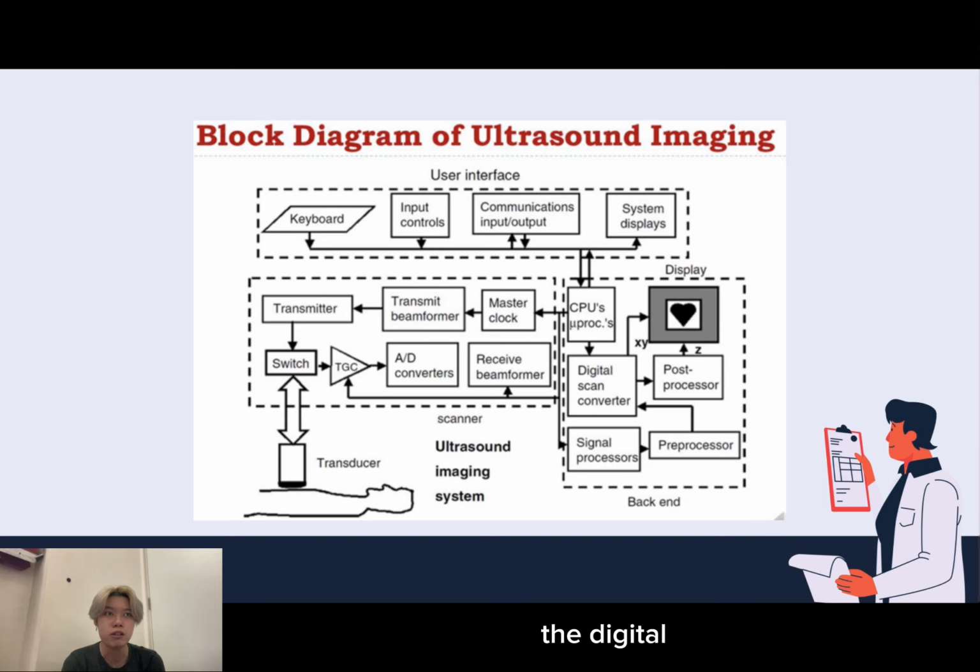The digital conversion allows for further manipulation of the ultrasound data. The receive beamformer processes the echoes received by the transducer elements and combines the signals from different elements with precise timing to create focused and high-resolution images.